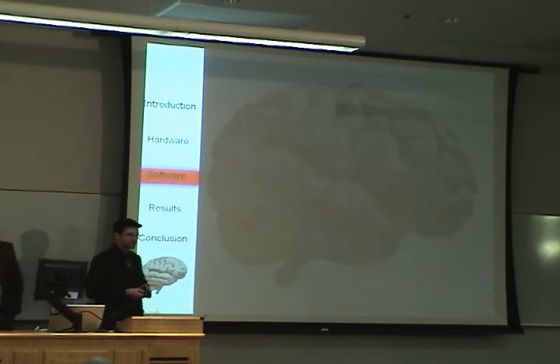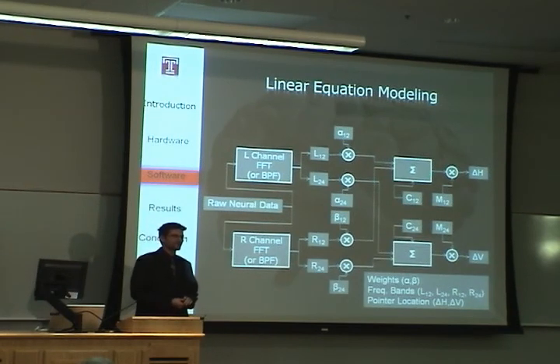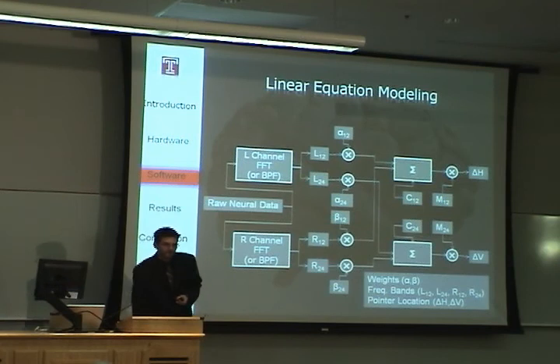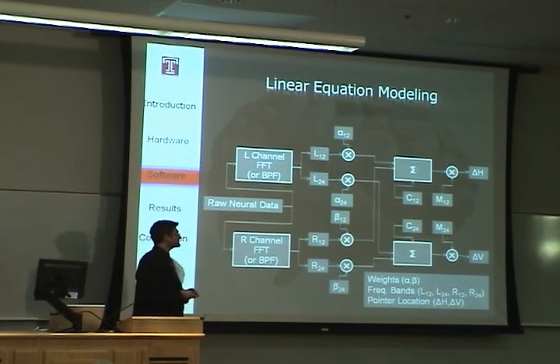Hello everyone, Jesse, in charge of software. And this project we had a pretty big undertaking. It's very complex, and in order to try to figure out the best solution for our given time frame, we went with the simplest solution. The simplest solution was to use a linear equation, which was already something found to work amongst the professional community. And so this is kind of the flow diagram of that same linear system.